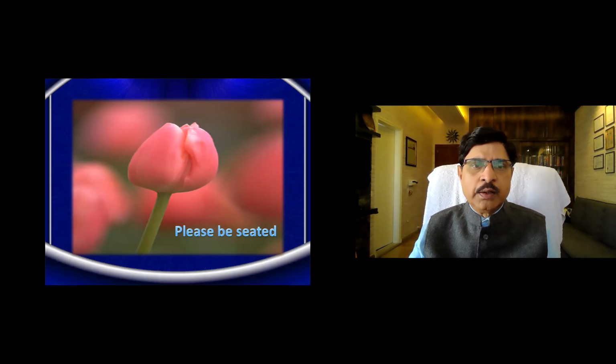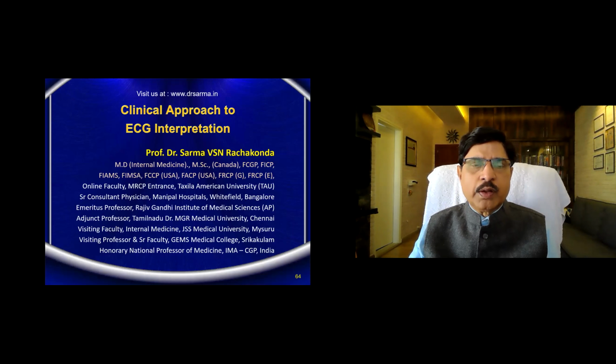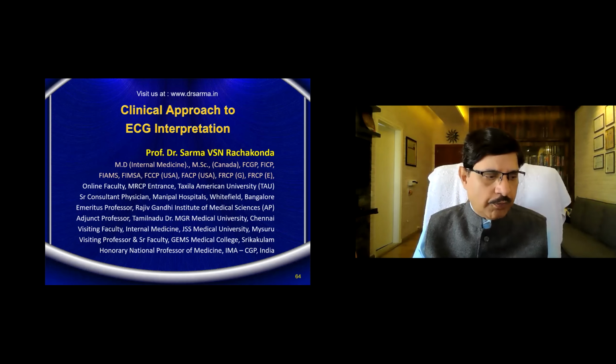today about hypertrophy. Atrial and ventricular hypertrophy will be today's topic. So this is the fifth lecture in the series, and we have the sixth lecture on the conduction defects, like bundle branch block, right bundle branch block, left bundle branch block, and all that.